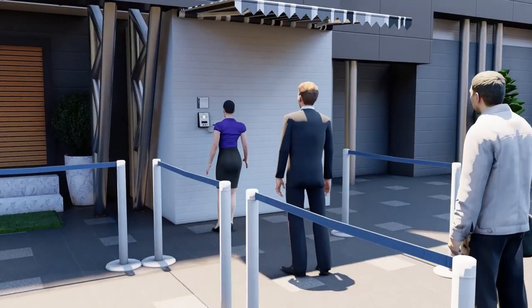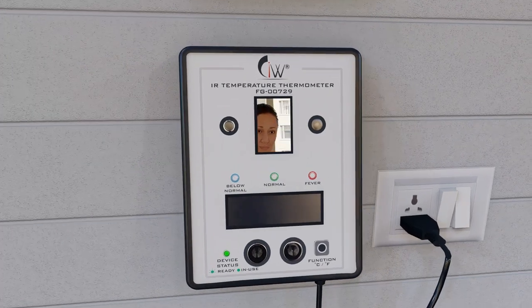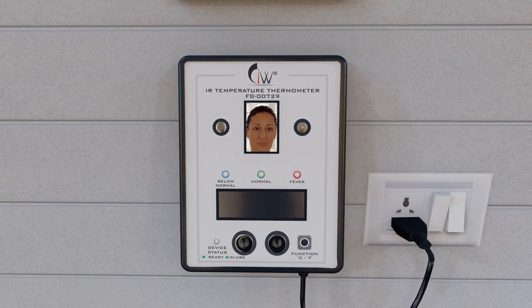This device is very easy to use. Mount the device at a four and a half feet height and just plug in to start. To turn the device from standby mode to active mode, simply stand in front of the device at up to 0.5 meter distance and adjust your face position to fully reflect in the mirror on the device.